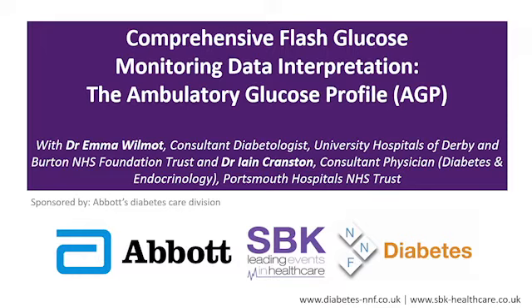Whereas if you have a very fat snake, so if you imagine, as you sometimes see on these David Attenborough films, the snake that's just eaten a deer or something like that, and it has this enormously wide belly, trying to predict on a given day where your sugar level is within that range is much more challenging. So the aim is always to think about ways in which one can reduce the variability and also reduce the flux across the day, or the so-called instability, so that it isn't high at breakfast and low at lunch or vice versa. It's just sitting as a happy medium all the way through.